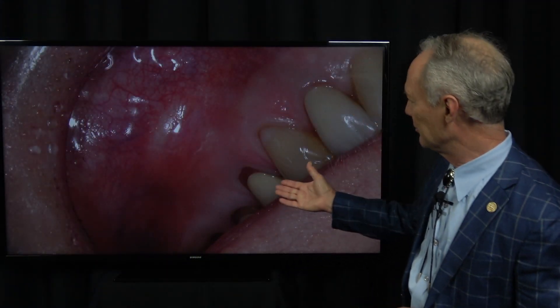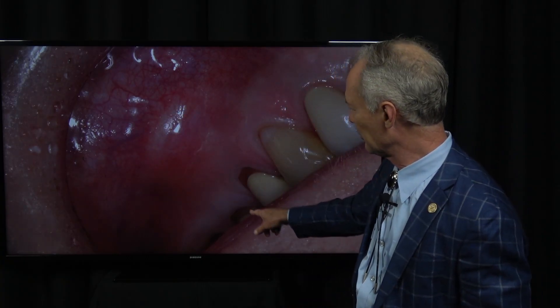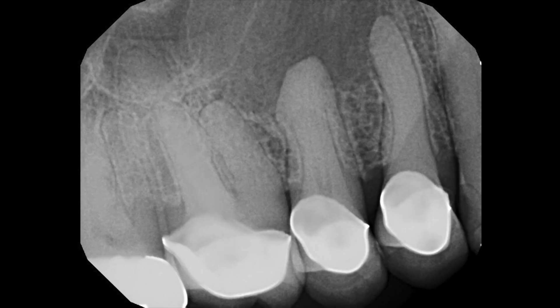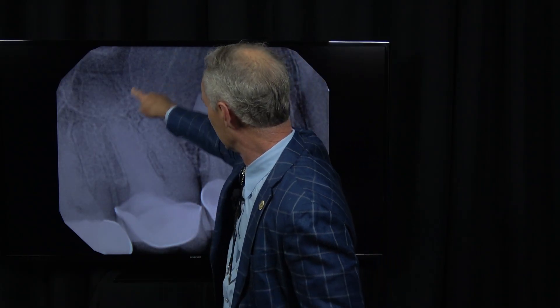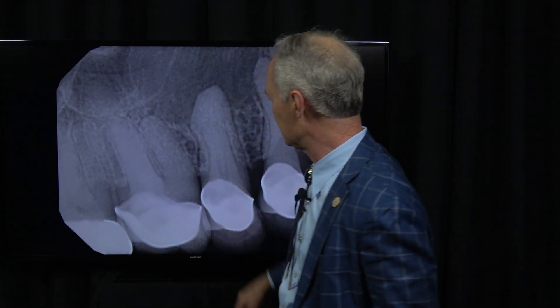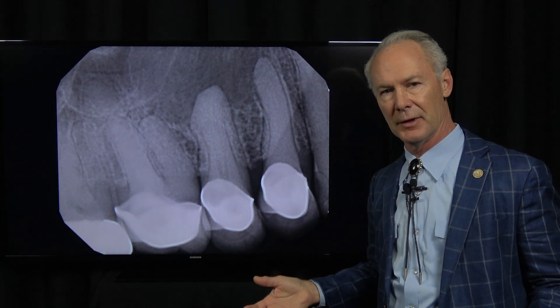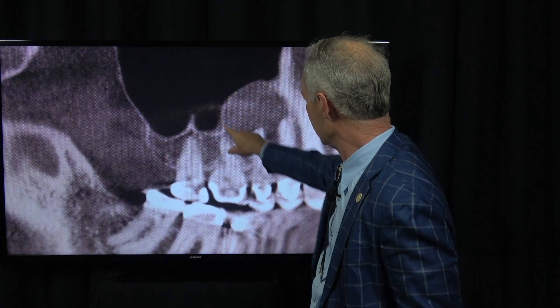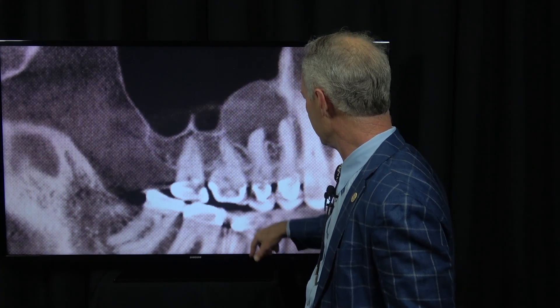This lady had a big abscess apical to the upper right bicuspid teeth. You can see the swelling right here. We took a periapical radiograph. You can see the radiolucency right here — it's a large radiolucency. To be sure of the extent of the lesion, we also had a cone beam taken. You can see this is quite a large lesion at the apex of both the bicuspid teeth.